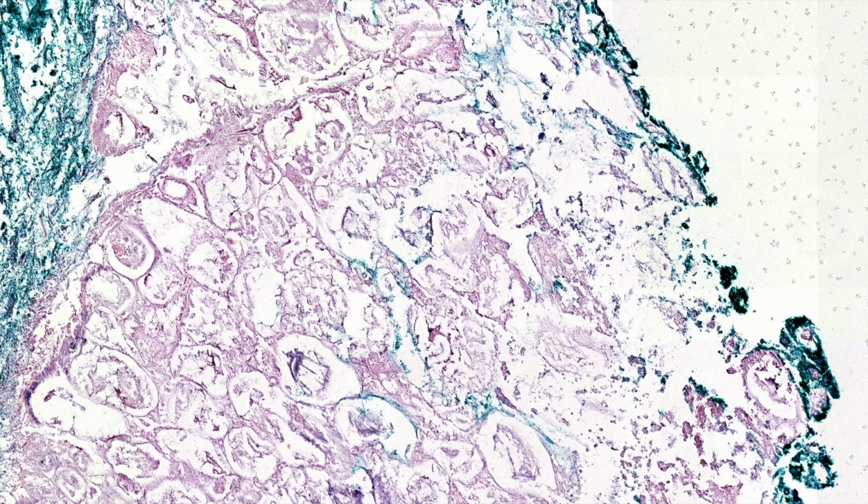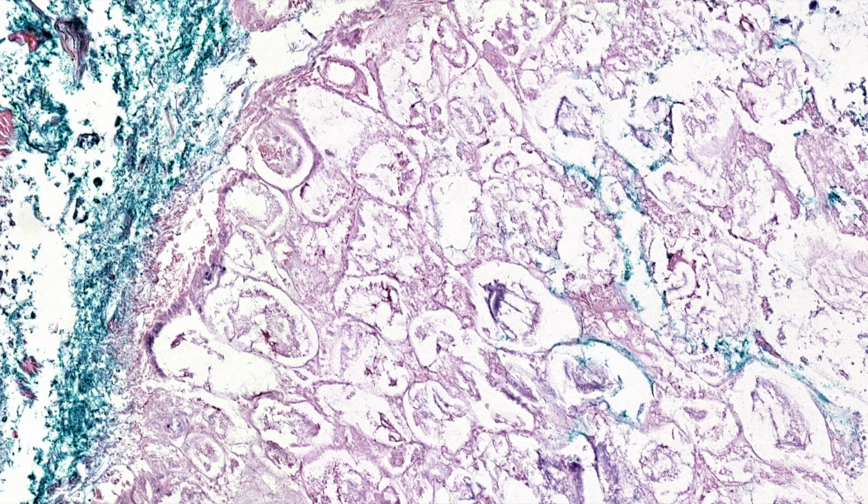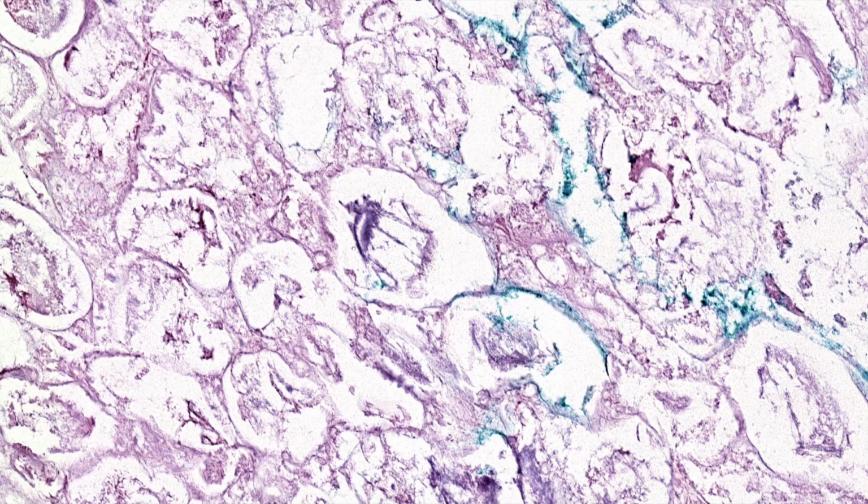Fat necrosis can have a variety of different patterns, right? And the usual one we see is little, foamy histiocyte xanthomatous cells, and then the fat cells shrinking down to various small sizes, with a little mixed inflammation. But this is different, right? This is like wiped out, dead. You can see the ghost outline of the fat cells, but it's more grungy, more dirty, more fibrillary. It's got this pink, smudgy stuff, which turns into blue and purple in areas. And exactly like you said, that's called saponification.